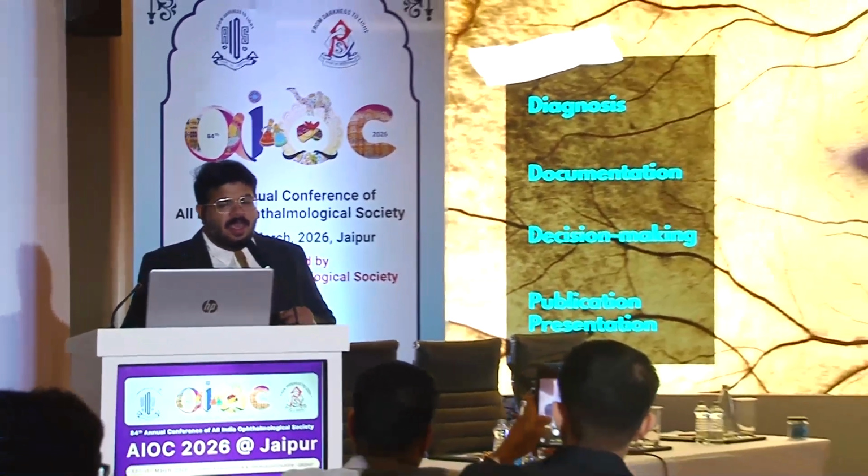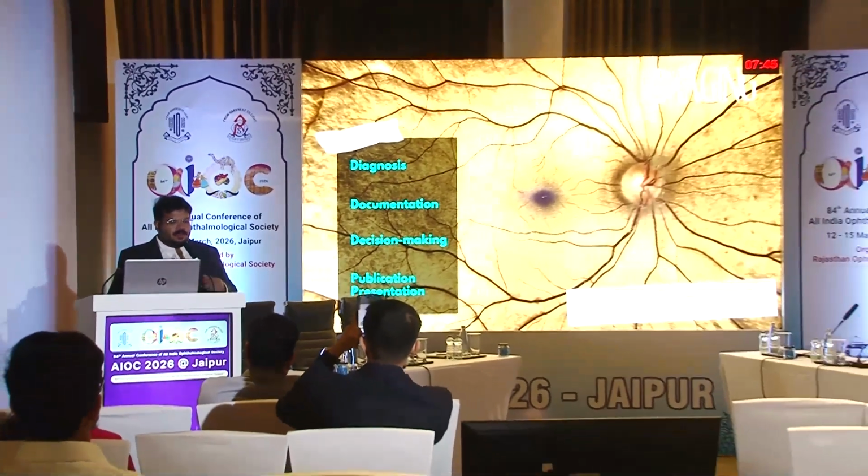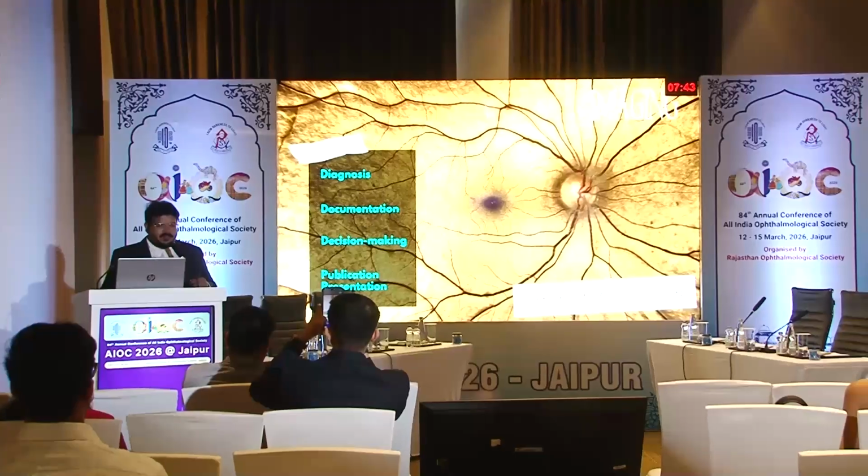Why is imaging important? It's a language of modern ophthalmology. It is involved in diagnosis, documentation, decision making, and also you can use those images that you capture for your publication and presentation as well.